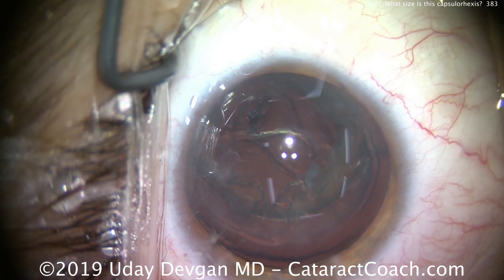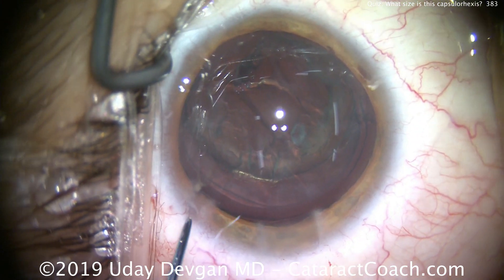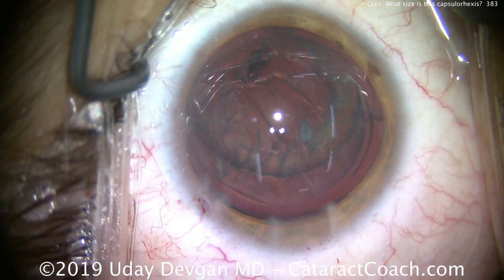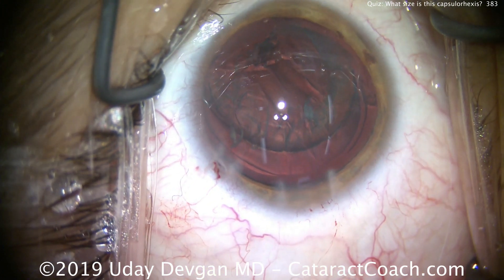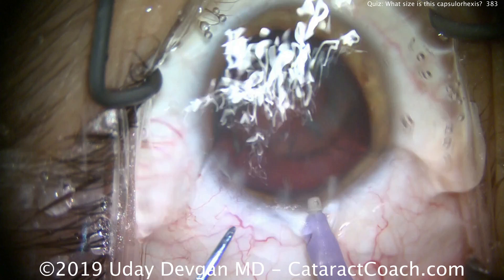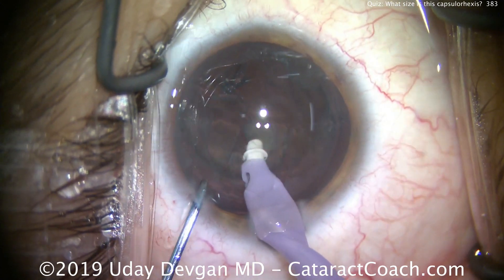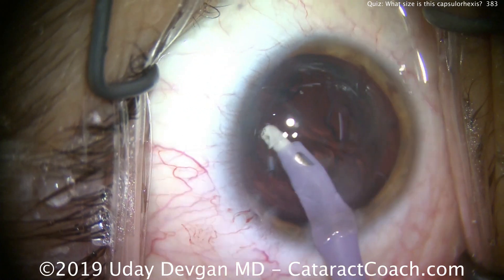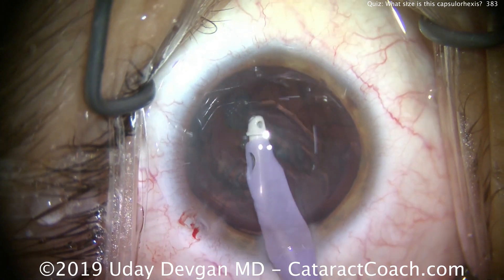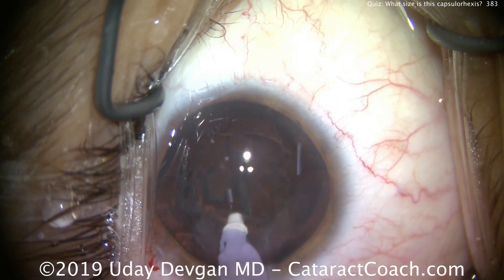We can aspirate some of that, but the rest we'll get with the IA probe. As we switch over to the IA probe and remove the lens cortex and epinucleus from the eye, we'll be able to see the capsulorhexis even more clearly. There's the IA probe going inside the eye, mashing down a little piece of lens nucleus, then grabbing the cortex and residual epinuclear shell.